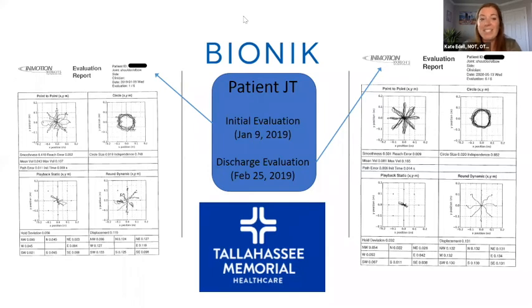These are fantastic. And that's a question we get all the time. Sheree mentioned therapists asking, is this replacing me? You know, is this taking away from my job? And absolutely no, this is a tool. We need your therapeutic use of self, your clinical judgment to decide what's appropriate and to then take it into the functional world. So thank you so much for these great patient examples.